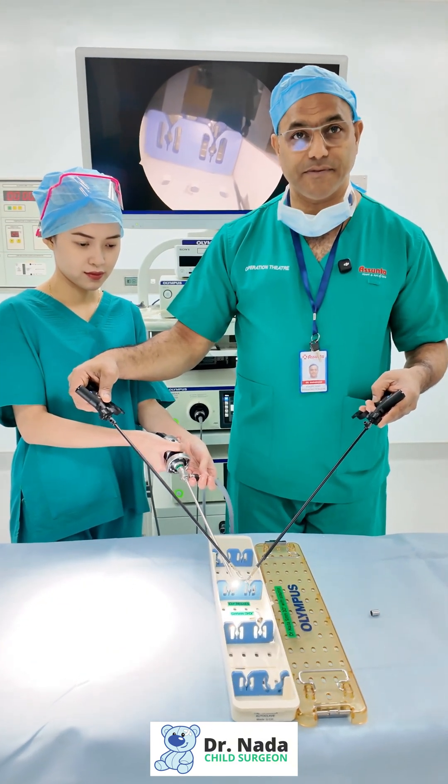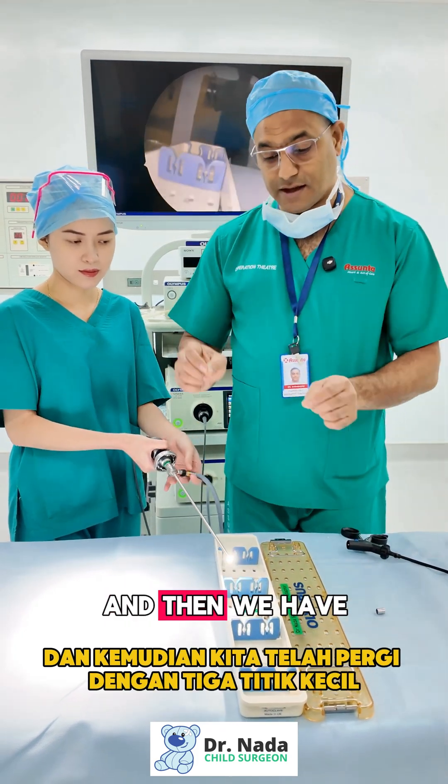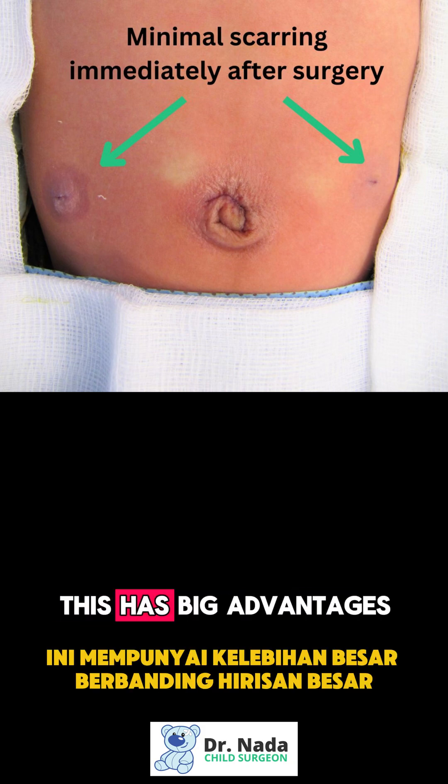Using three small incisions, we carry out complex operations inside the abdomen and chest. Once we're done, we pull out the instruments, pull out the ports, and we're left with three little dots that we cover with glue.